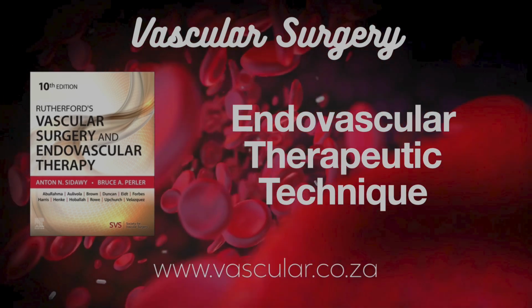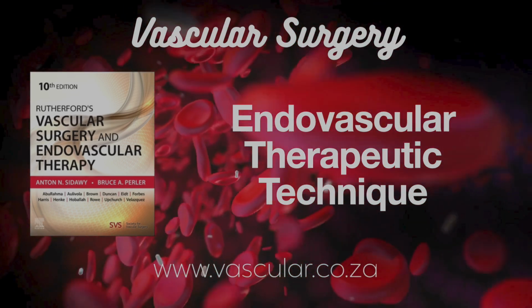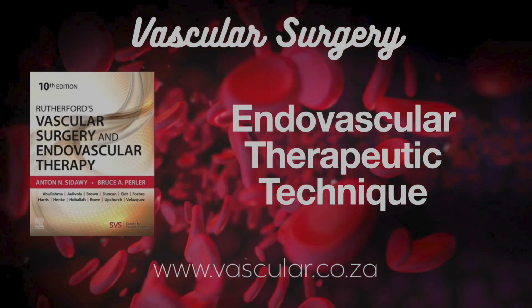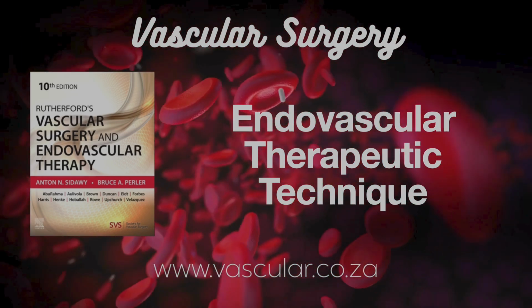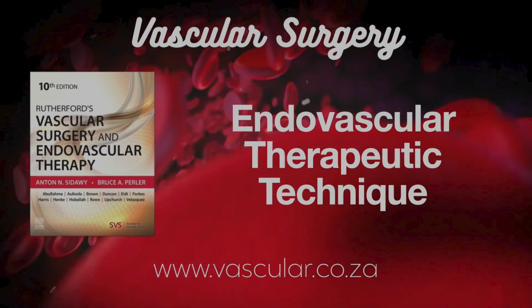VIASTAR compared Viabahn to bare metal stents in the SFA. Viabahn came out on top for 2-year primary patency, especially for really long lesions, 20 centimeters or more. Similar rates for avoiding bypass or re-intervention, but the pattern of re-narrowing differed. Viabahn tended to narrow at the edges, bare metal stents more diffusely inside. Deployment, wire size: Viabahn uses a thinner 0.018-inch wire, 6 or 7 French sheath, deployed with a ripcord.